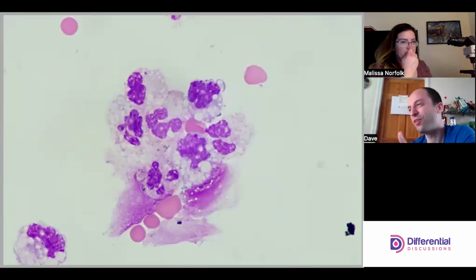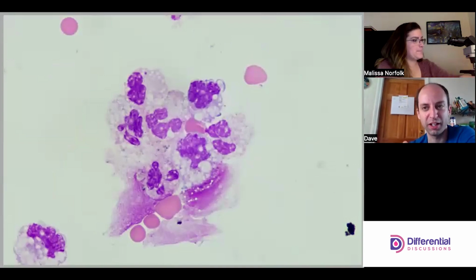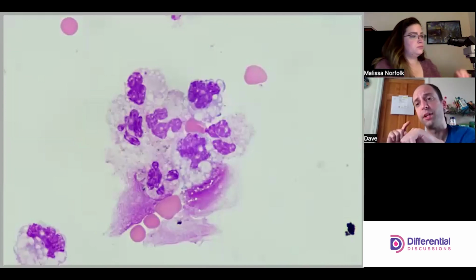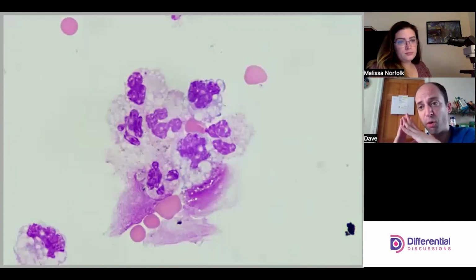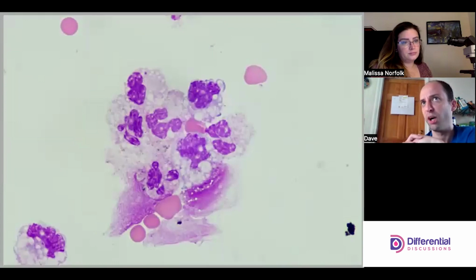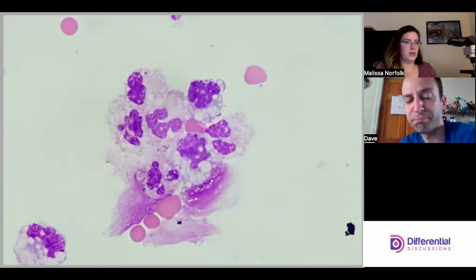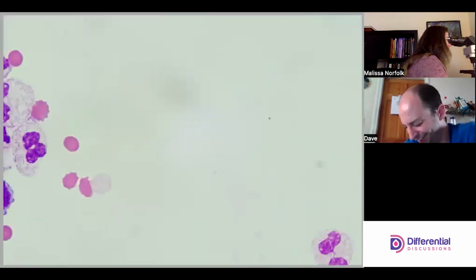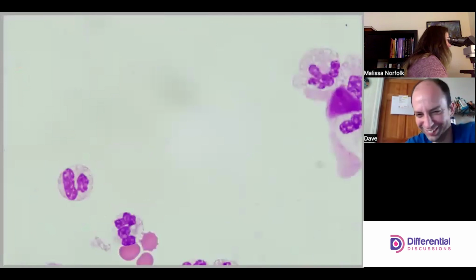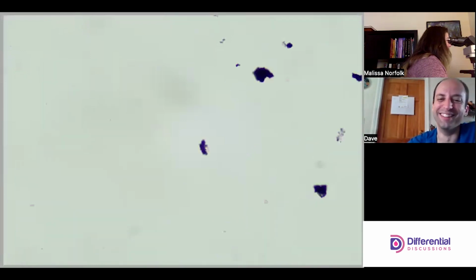What's significant about that is if you're seeing nucleated red cells in a CSF, one of the complications that can happen is that as you're sampling for the CSF, you could strike a vertebra, which might have hematopoietic bone marrow, essentially. And then you could pick up these really immature developing cells. NRBCs and really immature cells would all be signs of bone marrow contamination. If there's bone marrow contamination in this BAL, that doctor should be fired. That doesn't make sense.